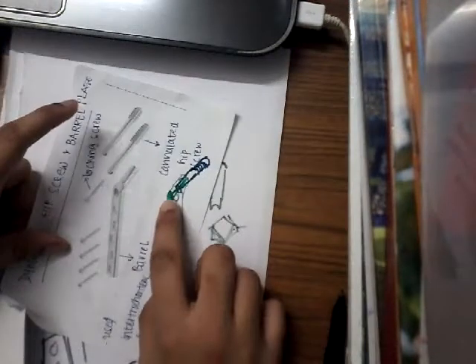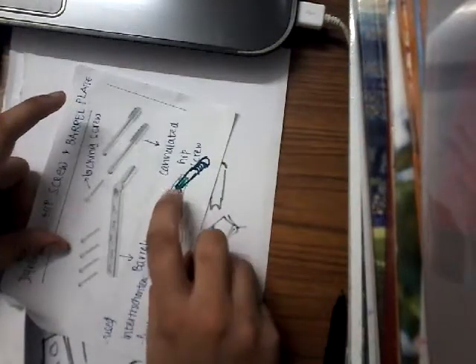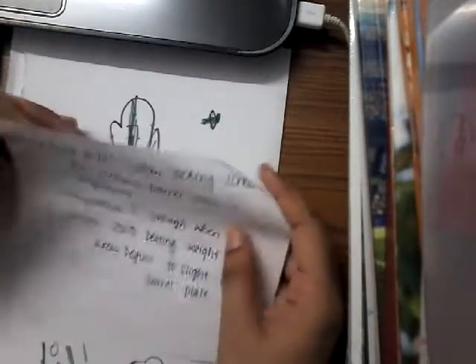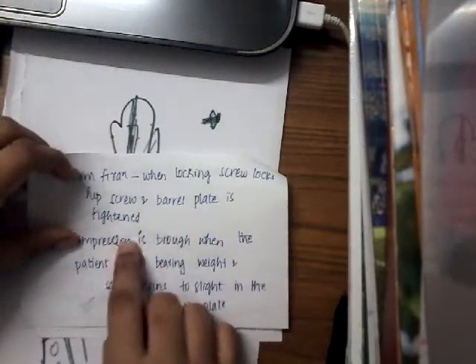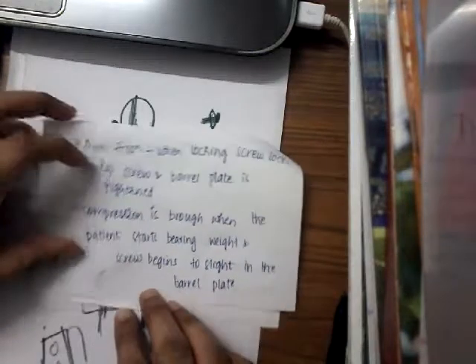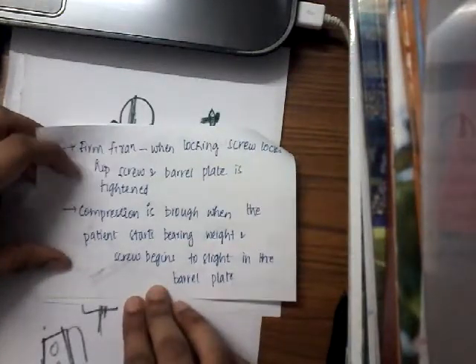The locking screw goes into the canal of the hip screw and locks there with the help of threads. When that is fixed, the barrel plate gets tightened and it tightly attaches to the bone. That is firm fixation.